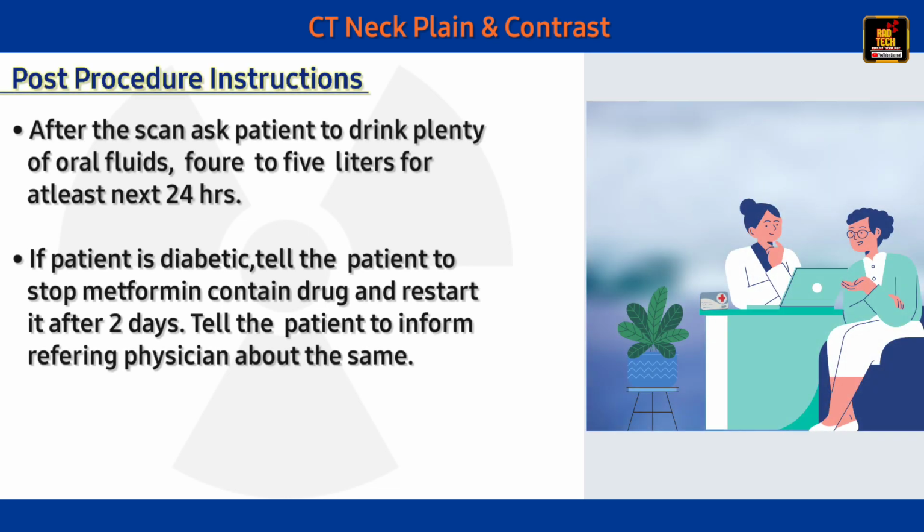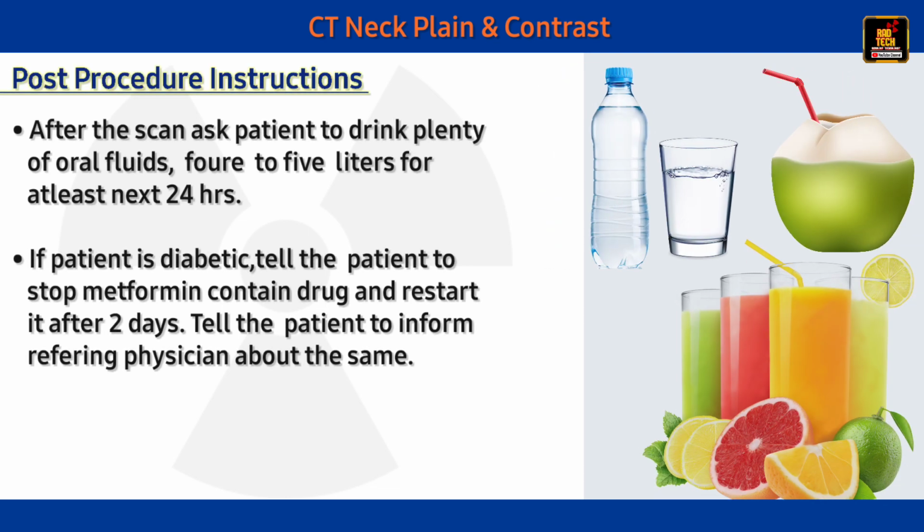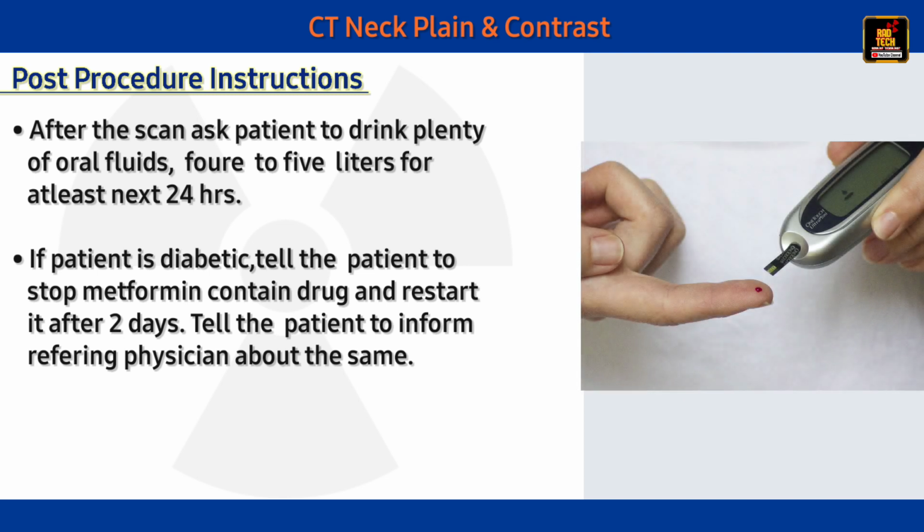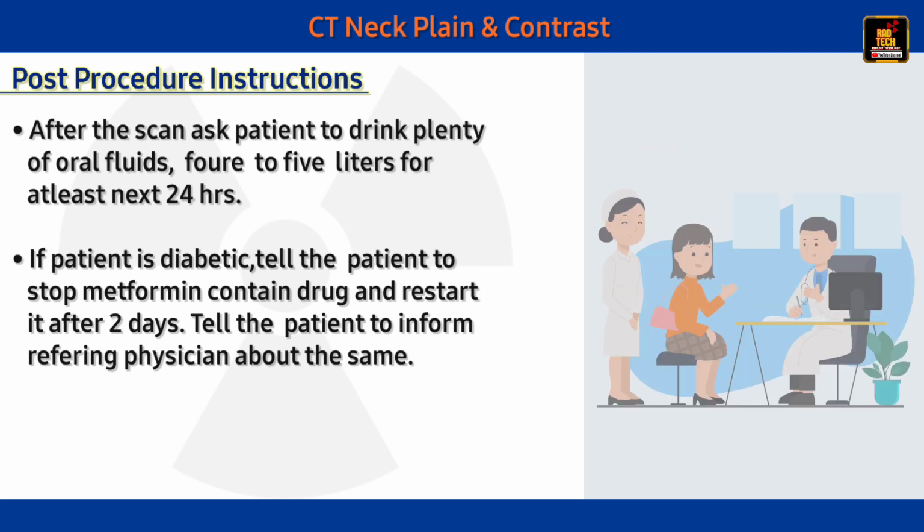Post-procedure instruction. After the scan, ask the patient to drink plenty of oral fluids, 4 to 5 liters, for at least the next 24 hours. If the patient is diabetic, tell the patient to stop metformin-containing drugs and restart them after 2 days. Tell the patient to inform the referring physician about the same.